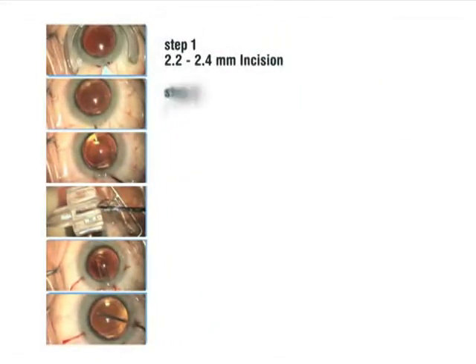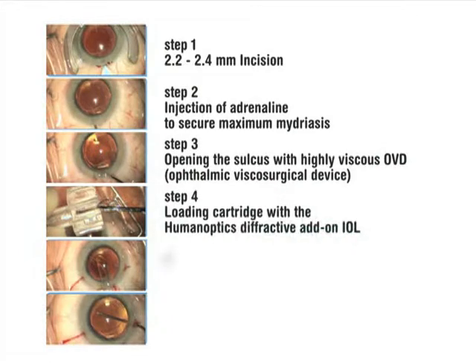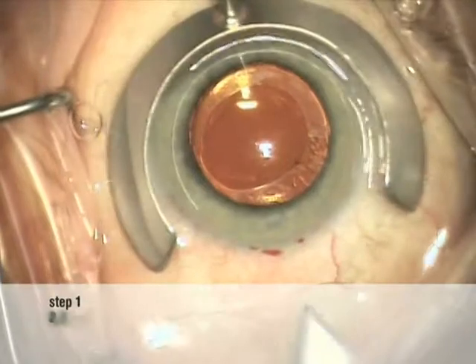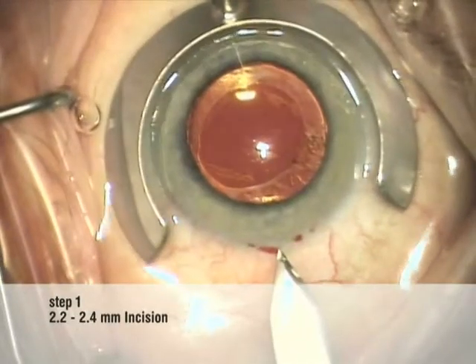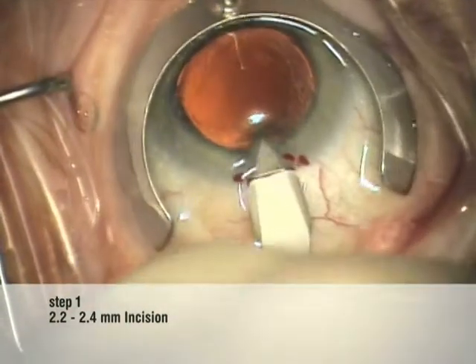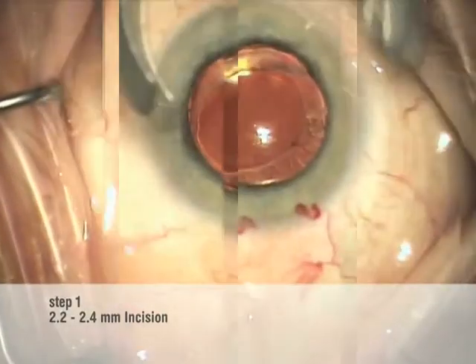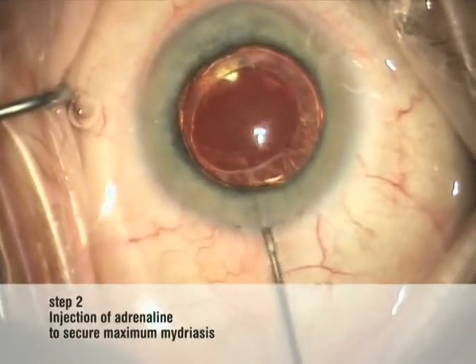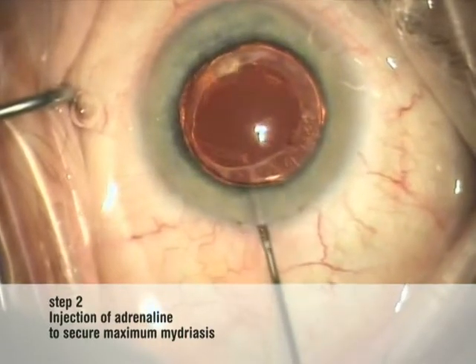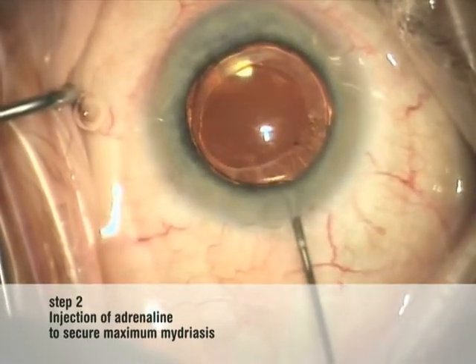This operation has six steps. A self-sealing temporal incision is created — this can be done either with a clear corneal or a posterior limbal technique with all standard blades. Maximum pupil dilatation is desirable; we like to flush the anterior chamber with an adrenaline BSS solution.